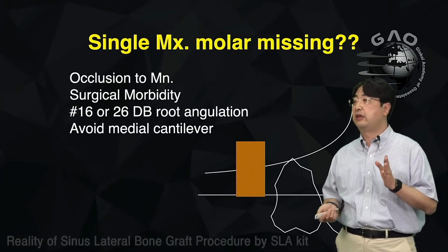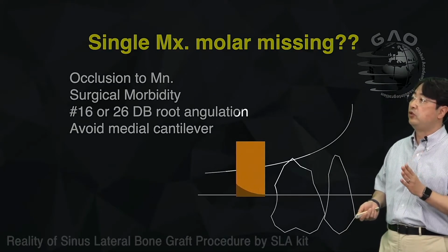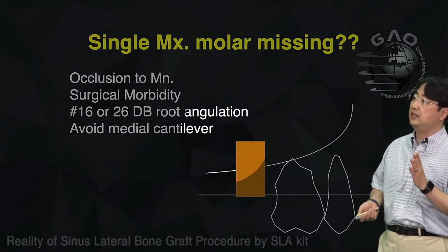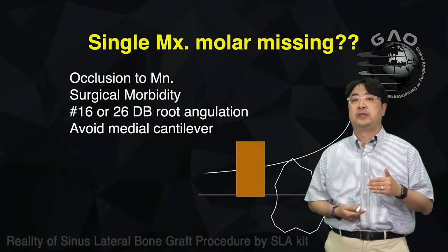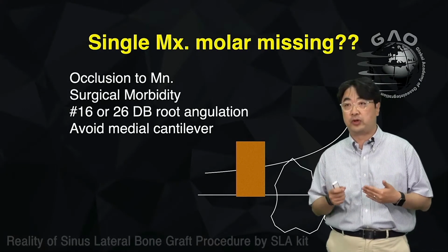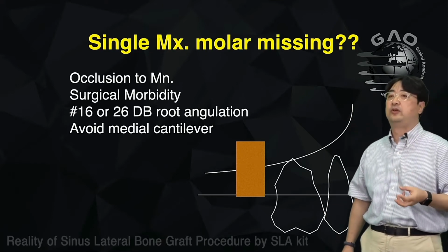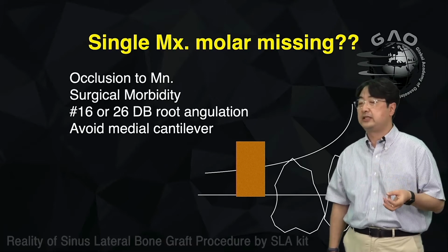Also, if the distal buccal root is too distal, then you may need to place the implant distally, and then it creates a medial cantilever as well. So that's not good from the mechanical point of view, right? So in those cases, I don't usually do the last molar replacement with the implant.